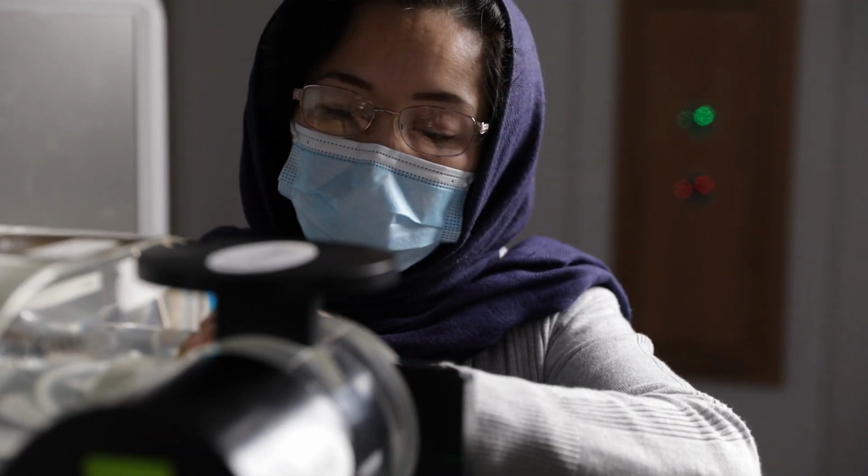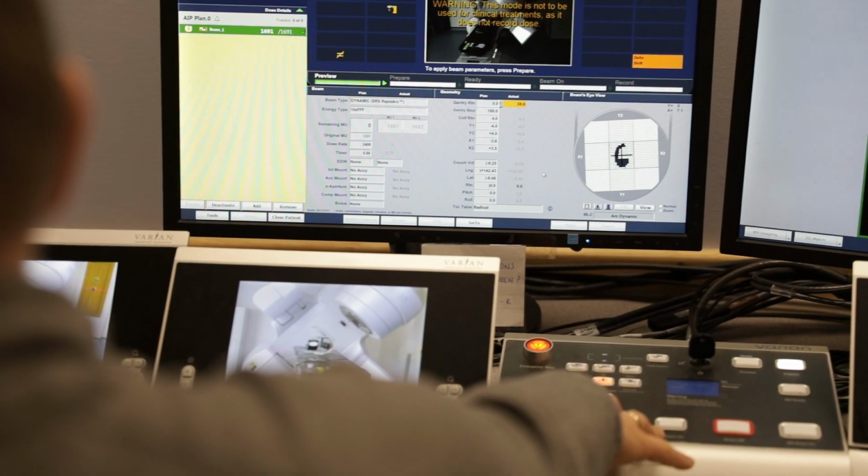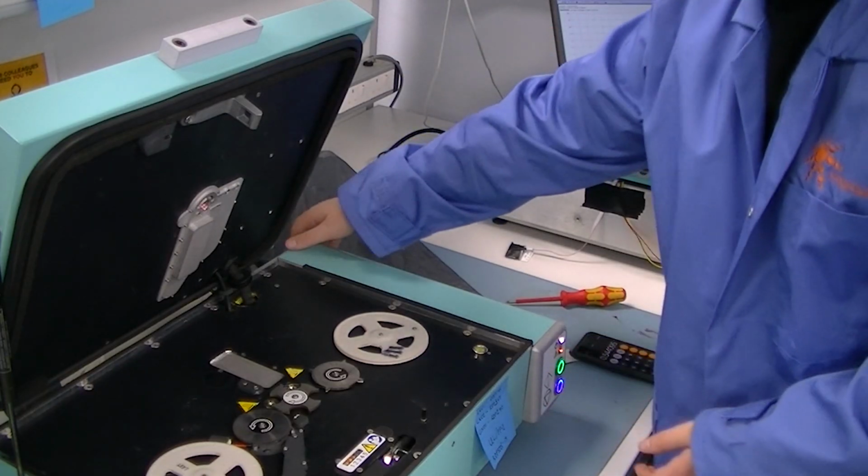Silica beads were very useful to measure the dose within the moving target and ensure us that the dose that we are going to deliver to the patient is actually predicted well within our treatment planning software. The beads then were read out using a TLD reader.